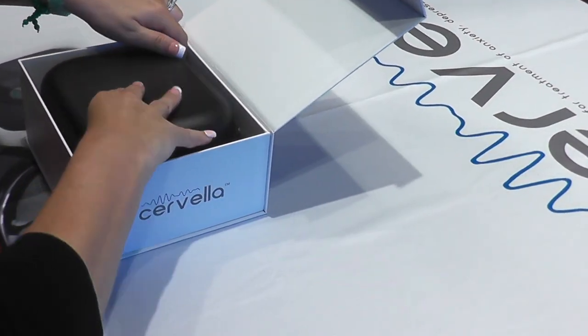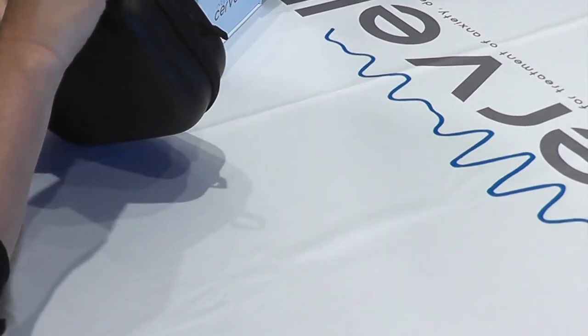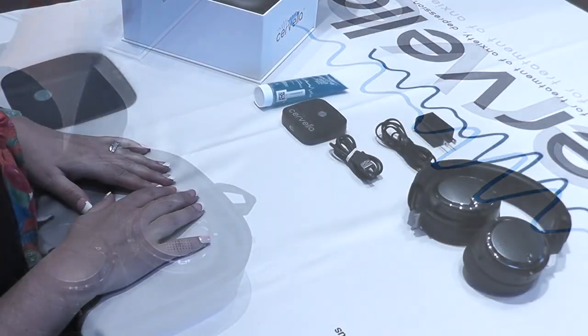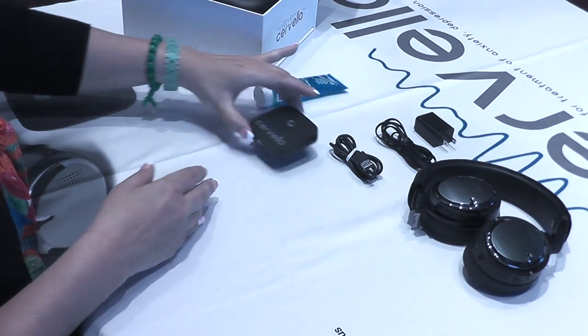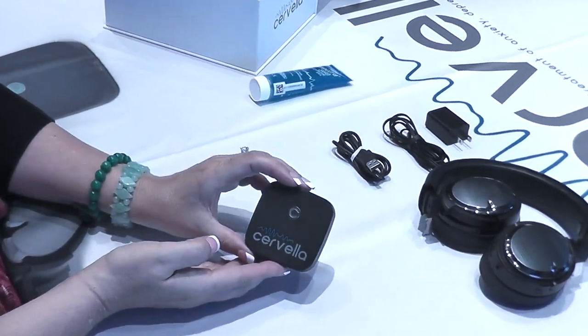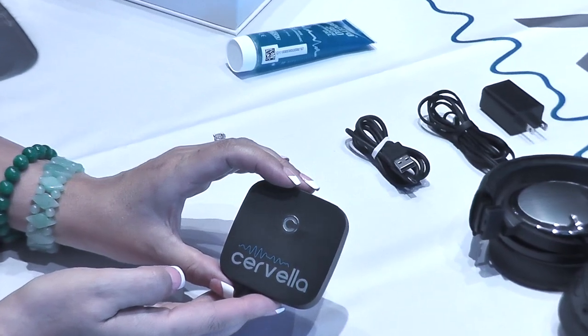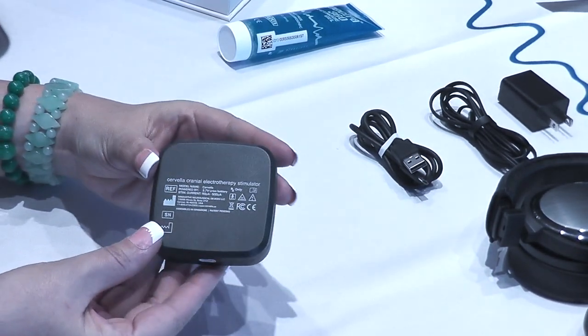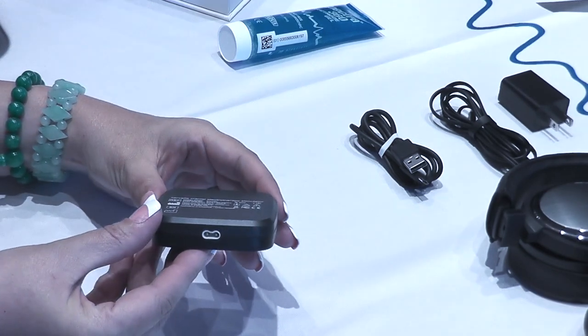Let's open the Cervella box and examine the contents of the Cervella system. This is the Cervella main device. It generates microcurrents of electricity that are delivered to the patient's brain, communicates with the Cervella app, and contains a rechargeable battery.